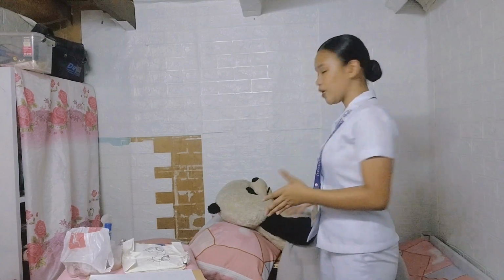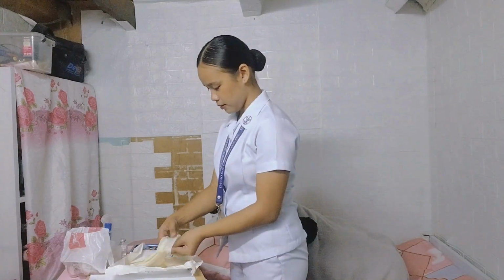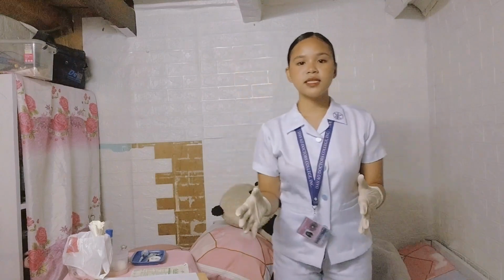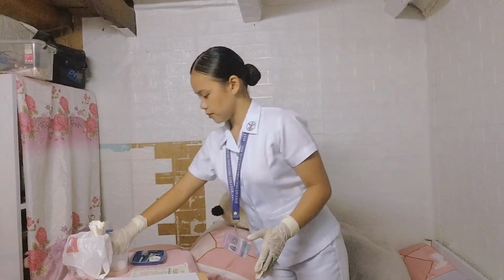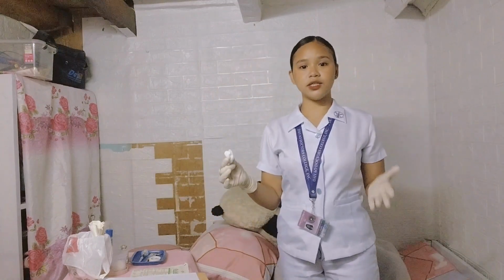Before doing the procedure, let me first apply clean gloves. And now clean the site with an antiseptic swab or cotton balls soaked in 70% alcohol, using a circular motion.